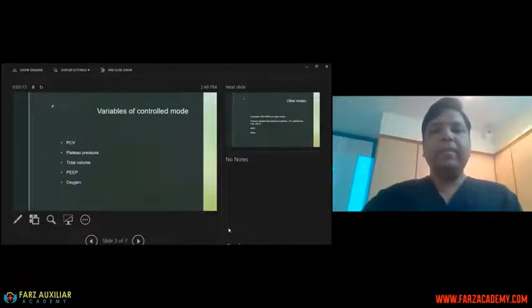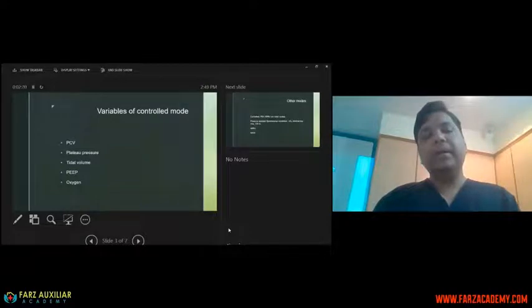Now, what are the variables? The most commonly used mode of ventilation is controlled mode of ventilation. And although volume control was initially the mode of choice, slowly people across the world are moving towards a pressure controlled mode of ventilation.